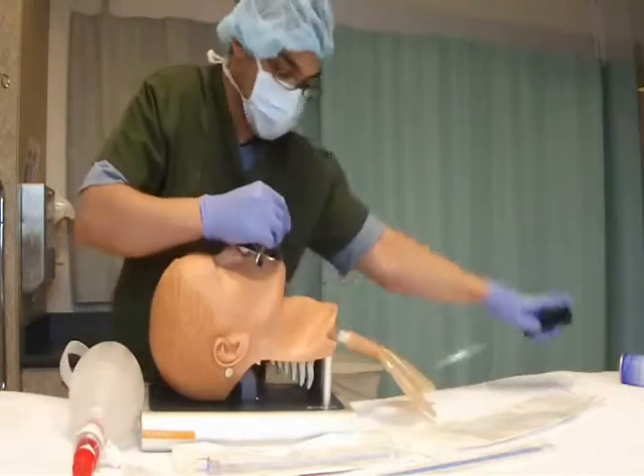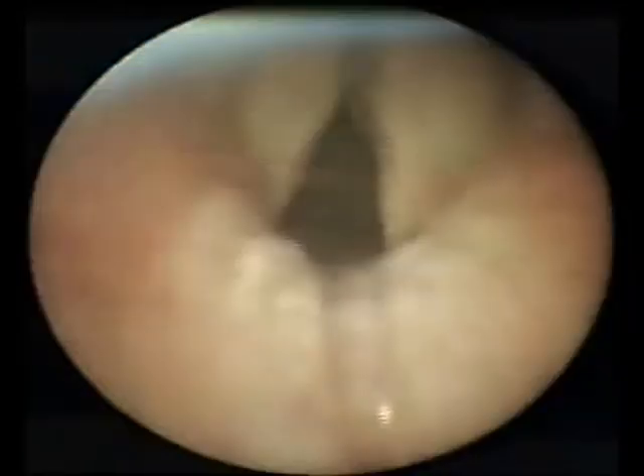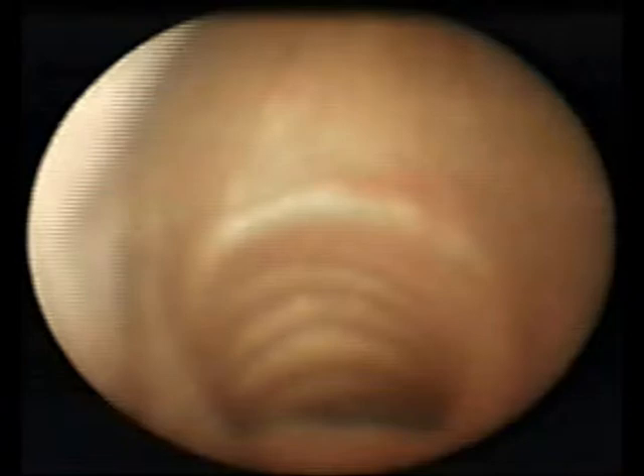As soon as I enter the trachea, I take out the stylet in one sweeping motion. To revise: see the stylet going through the patient's teeth, follow the base of the tongue, see the epiglottis, go below the epiglottis, visualize the vocal cords, go towards the vocal cords and through them until you reach the trachea. Once inside, push the ET tube under direct visualization and withdraw your stylet.